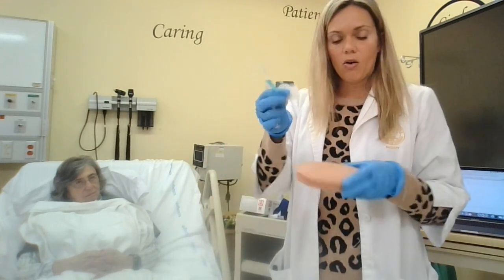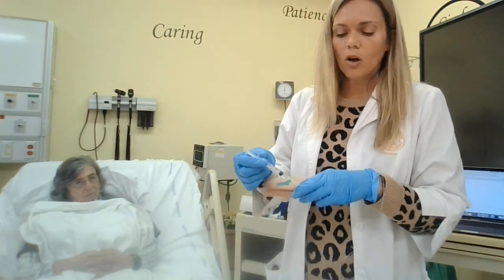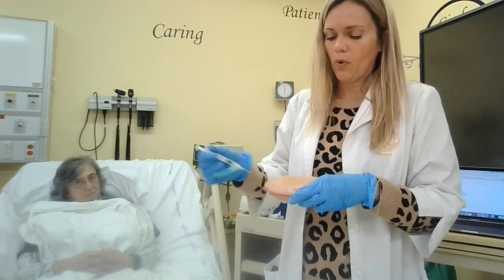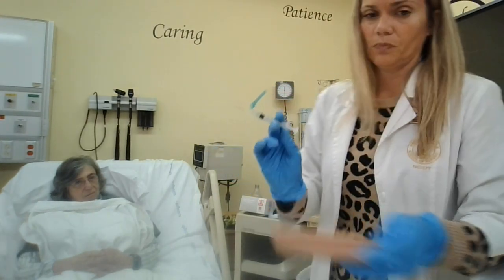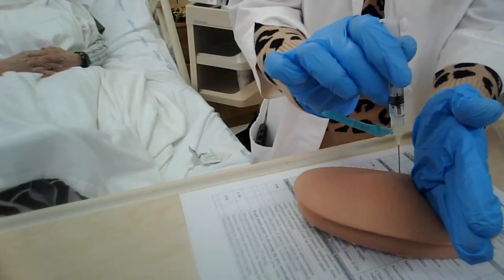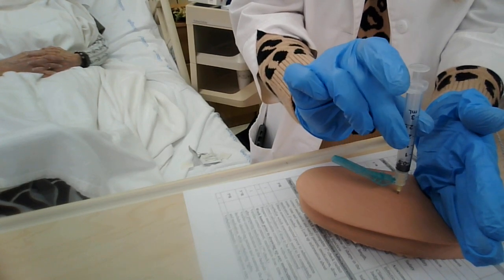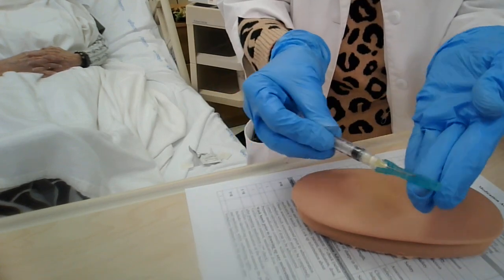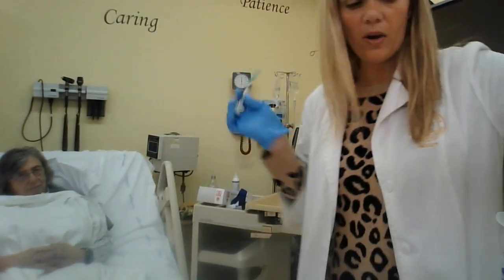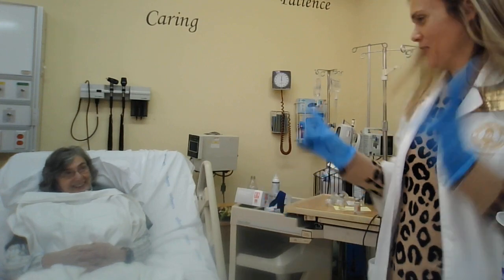So same thing, I've got my alcohol swab. I'm going to clean the area and let it dry. With an IM, you can go in at 72 to 90 degrees, okay? Now to Z-track, before I go in, you're going to slide that tissue over. Let's see if we can do it on here so you can see it. So you're going to feel a poke on 3. 1, 2, 3. And I'm going to administer the medication. Hold, 1, 2, 3. I'm going to let go, take out the needle, and engage my safety. Okay, so then we can get that away. If you've got a sticker or a lollipop for the patient, you can give it to them now for doing so well for 2 shots.